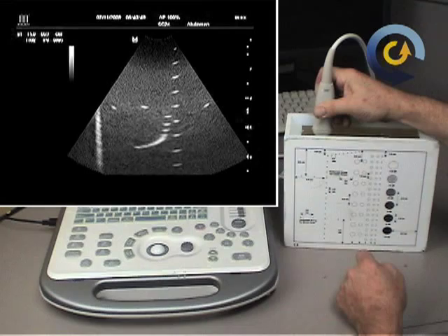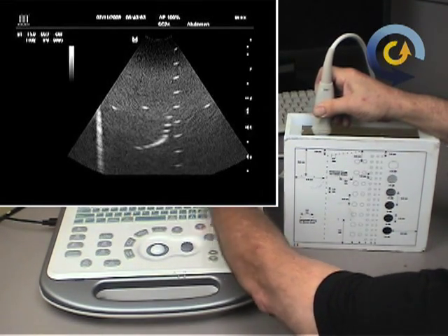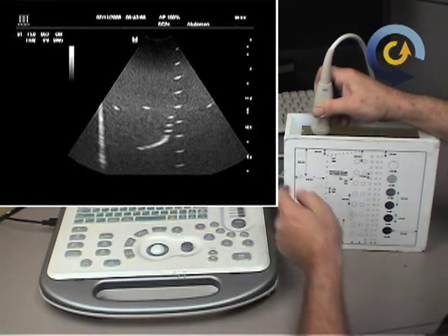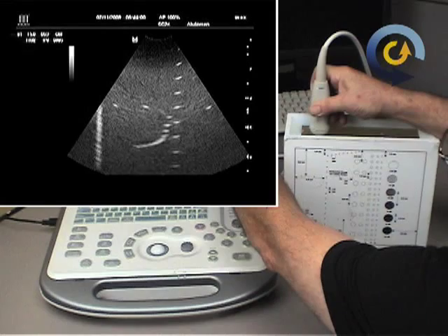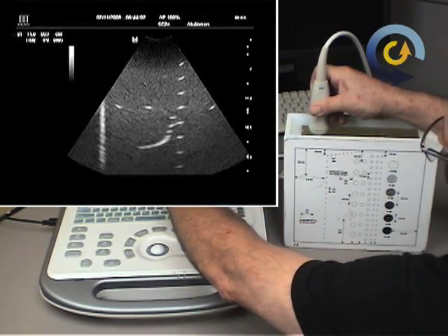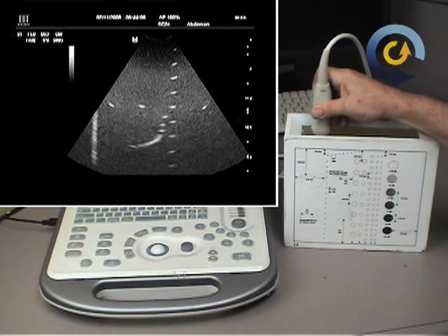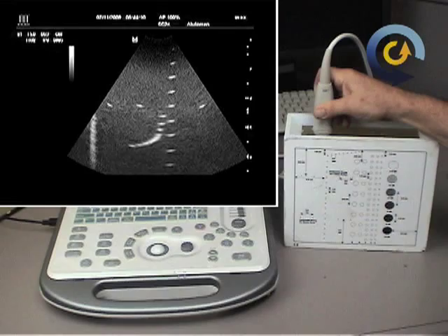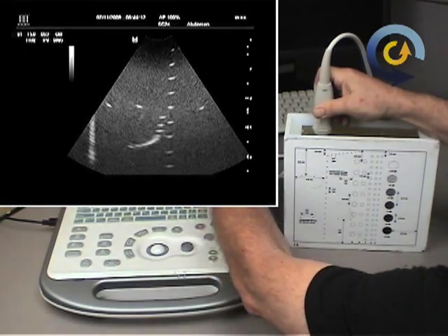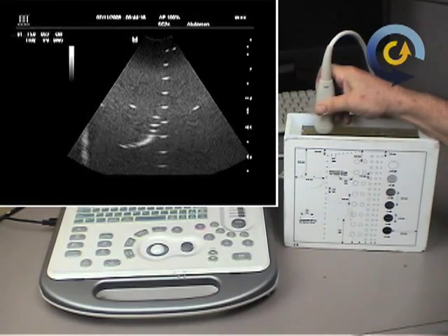And when you look at your resolution, you're looking for axial resolution along the axis of the plane and lateral resolution. And what you can see is that the axial resolution is quite good. Very small in this direction. Lateral resolution is not so good. It's spreading out. That's just a function of the type of transducer I have here. I have a high frequency curved array transducer. The curved array spreads out farther, just like the spokes of a bicycle, and you'll get worse resolution on there.